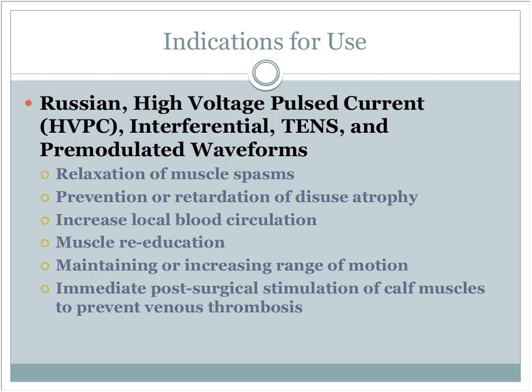Certainly muscle reeducation. You can maintain or increase range of motion. That can be done through muscle reeducation. That can be done by increasing the blood circulation so there's more fluid elasticity in the area. That can be done through pain control. If it hurts to move that joint, well, decrease the pain and maybe they can move more.